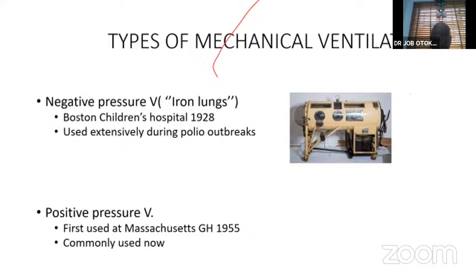We're done with some definitions. As we read more about mechanical ventilation, more definitions will come in as products increase in number. But look at the types of ventilators. One, we have negative pressure ventilation, and then positive pressure ventilation.